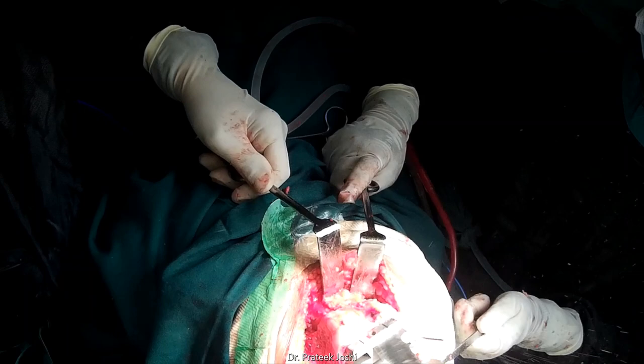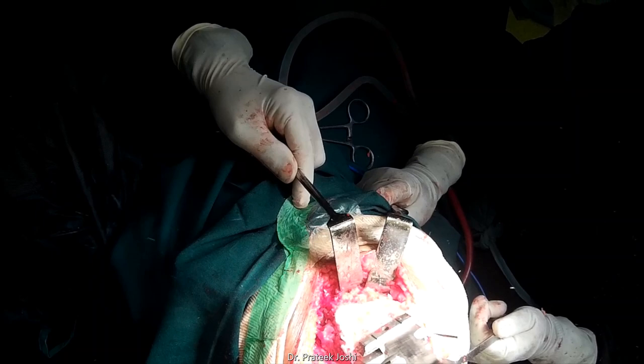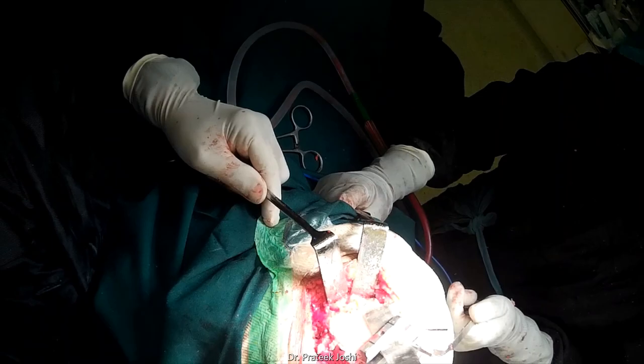Now confirming that there is no notching, all the cuts of distal femur, that is anterior cut, posterior condylar cut, superior chamfer cut, inferior chamfer cut and trochlear cut are executed.